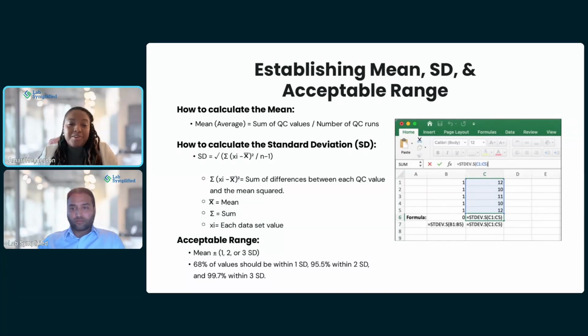I don't know why the QA person wouldn't have picked up on such an extensive period of your QC being out. But definitely once you reach that point where you can't get the mean in for your shift, we're going to have to try to pinpoint what's going on, what's causing your issue, so that we are not reporting out improper patient results. So definitely I would stop testing at that point.